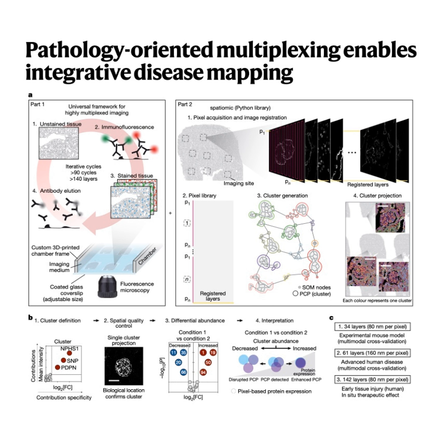That implies these clusters could be really powerful biomarkers. Could the software actually tell the difference between DKD and control samples just based on the cluster data alone? They tested that using computational methods like unsupervised analysis. And yes, just using the relative amounts of the different PathoPlex clusters, the algorithms could distinguish between the DKD samples and the control samples with, quote, perfect accuracy. Perfect accuracy. Okay, that definitely validates the biological significance of these signatures.